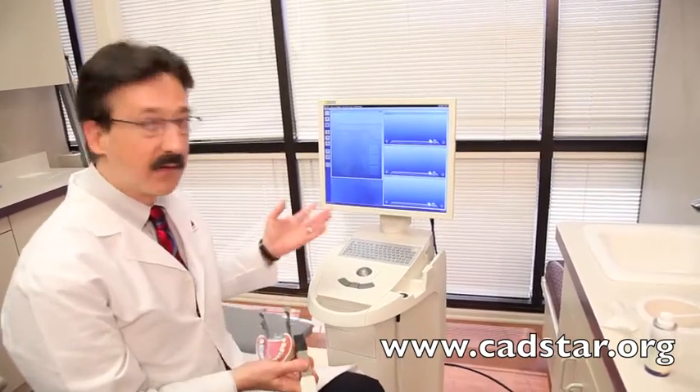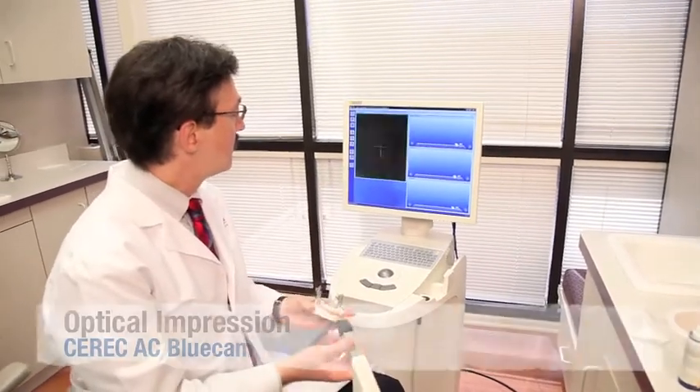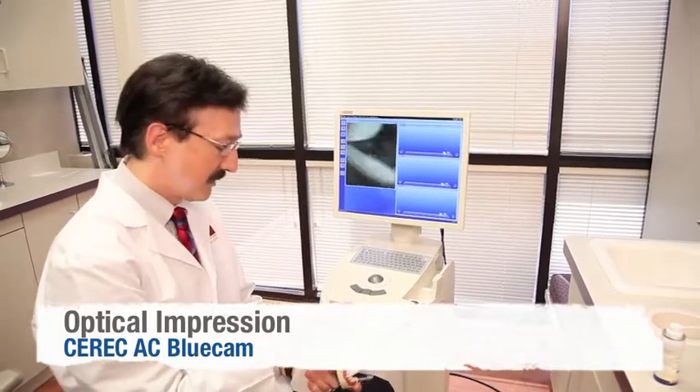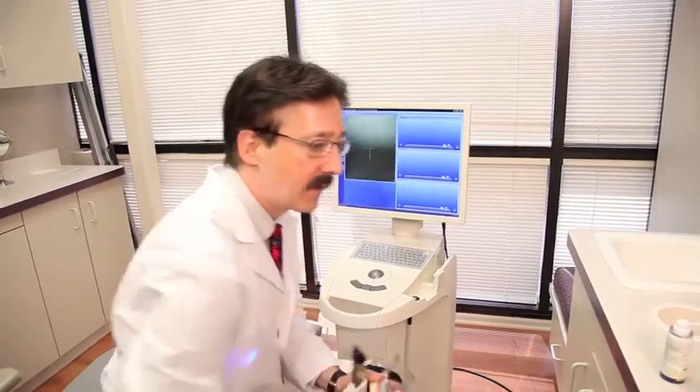The way we activate it — there are several ways — but the left mouse button activates my camera. Once my camera's going, you want to make sure that the screen is clean. I see a fingerprint on there, so we'll take the fingerprint off, even though that would be blocked out by the software.